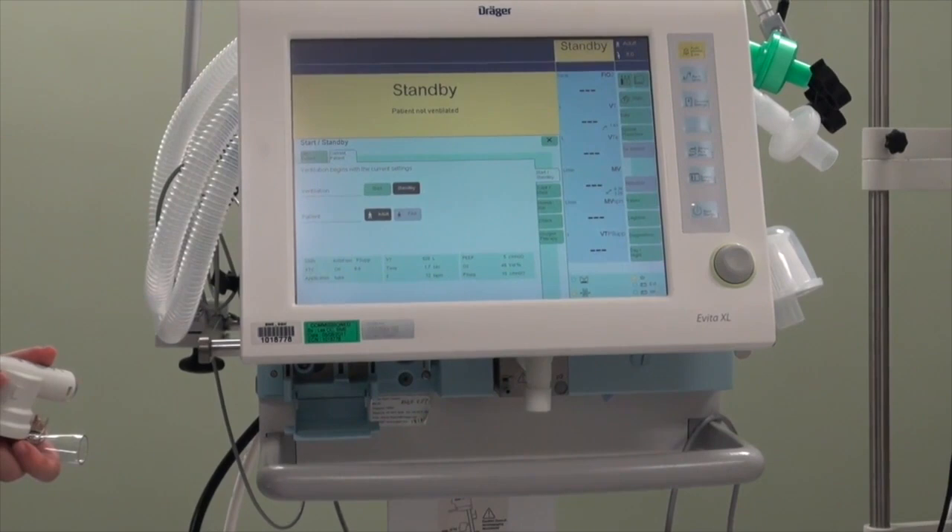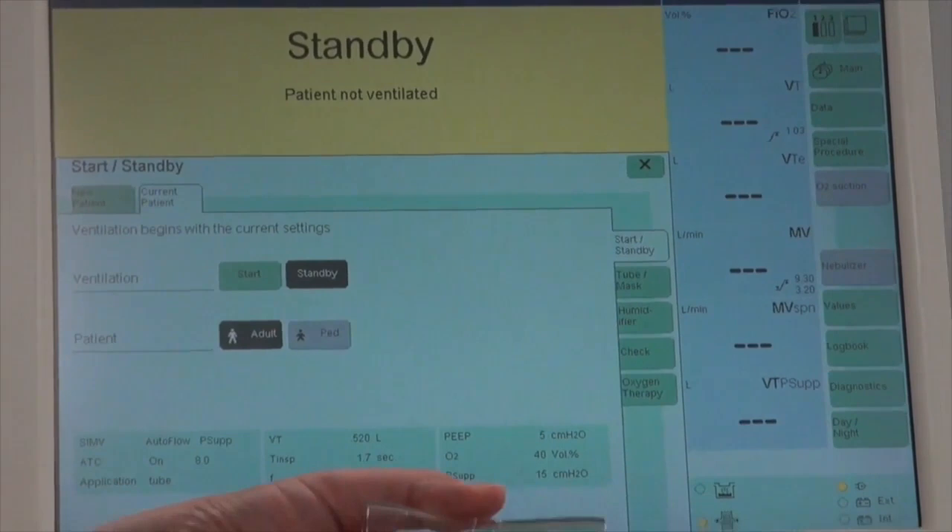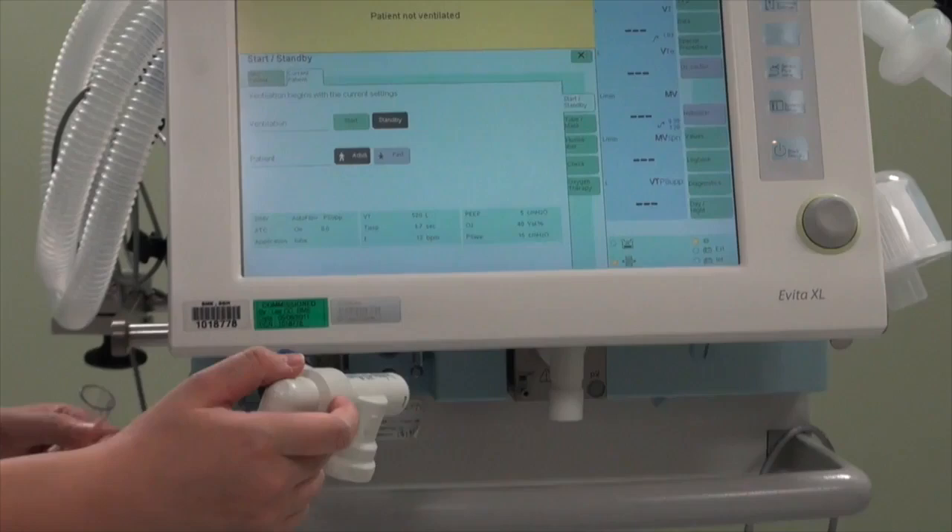After your ventilator is turned on, we need to do a pre-use check of the ventilator and patient circuit before we can use it. For the Draeger Evita XL, in addition to the patient circuit, we need a flow sensor and an exhalation valve.